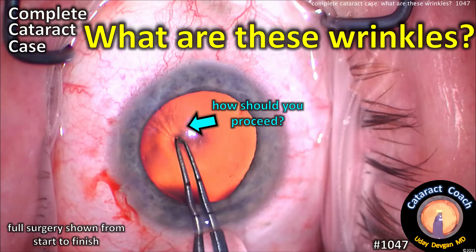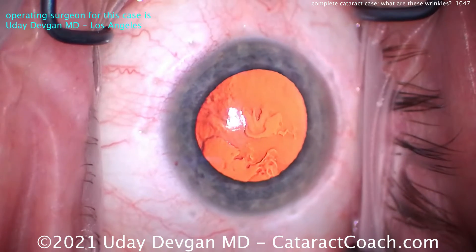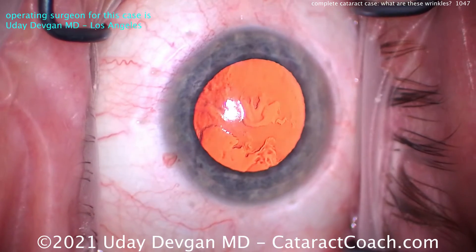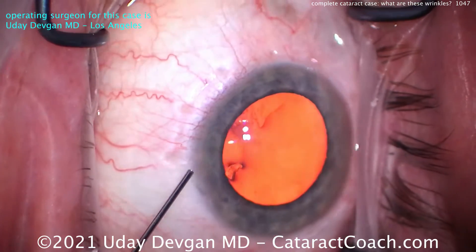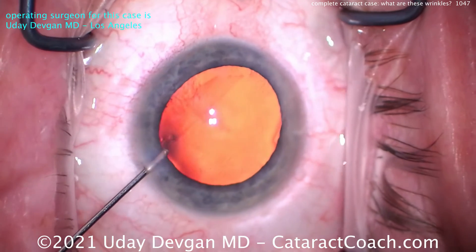CataractCoach.com — complete cataract case. What are these wrinkles and how should you proceed? Let me show you the whole case from the start to the finish. Good draping, lashes out of the way, lid margins sequestered. Here's our paracentesis; we're going to put some anesthetic in the eye. The patient has about one milligram of midazolam intravenously.